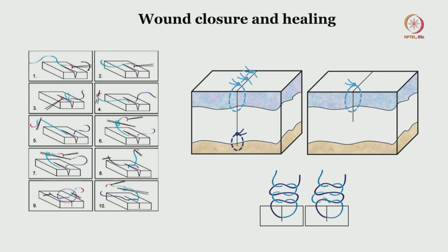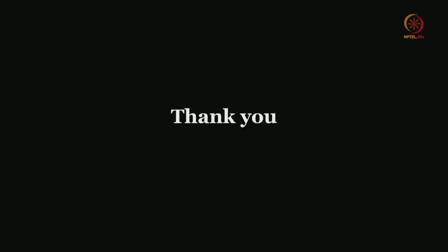practice to master wound closure. Generally, if you use postoperative antibiotics and good postoperative care, the wound healing is pretty good. So far I have not seen any gross infection of the wound or gross wound gaping after the surgeries. The scalp layer is very rich in blood supply, so the healing is pretty good, and you can handle it with simple sutures. If it is really a big hassle, surgical staples can be used, which clip the 2 edges by delivering a clip. So that is the end of today's session.